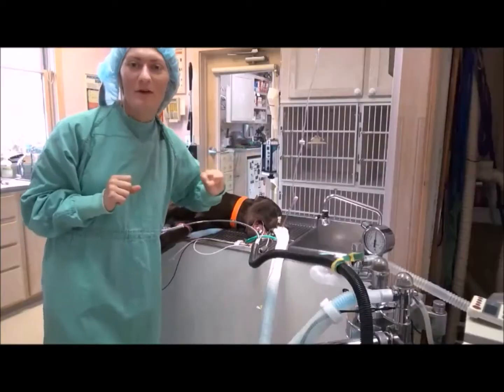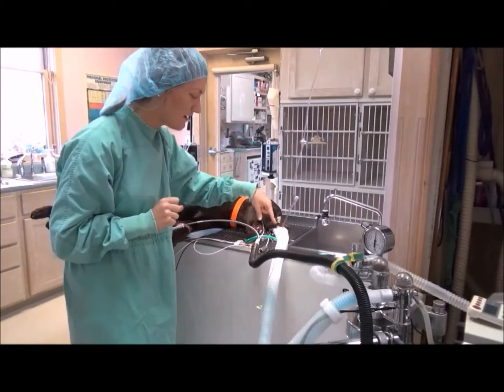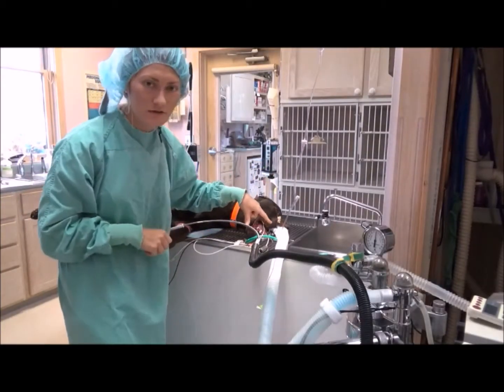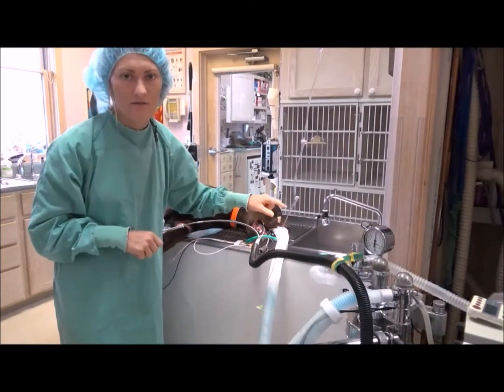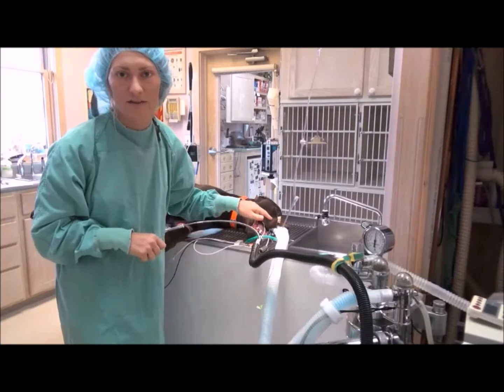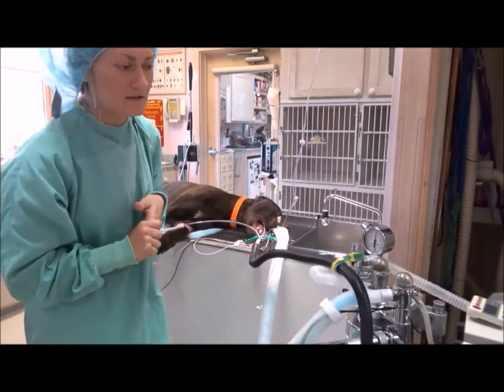The respiratory monitor is located between the endotracheal tube and the rebreathing circuit, and it's set to sound an alert every time the patient doesn't take a breath for 10 seconds.